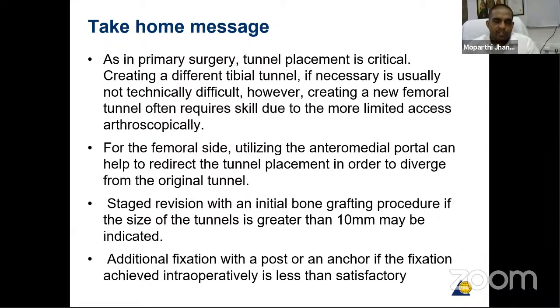Next, you can use the anteromedial portal, because there are some studies showing that doing the primary ACL with the transtibial technique will have a lesser chance of revision compared to using the true portal, that is the anteromedial. Whereas coming to the revisions, they are saying the anteromedial portal helps to redirect the tunnel placement in order to diverge from the original tunnel.